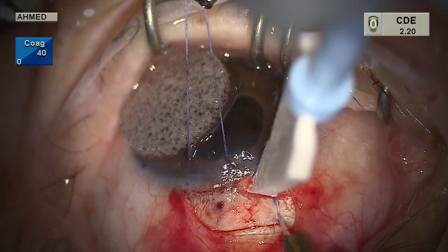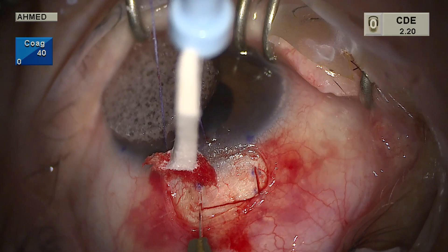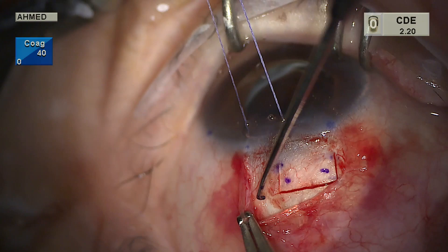We have now entered into clear cornea at least one millimeter anterior to the surgical limbus. The diamond trifacet blade is used again to connect the radial edges of the flap, creating a two millimeter long flap with a 3.5 millimeter wide base. Note how nice and smooth that dissection is.